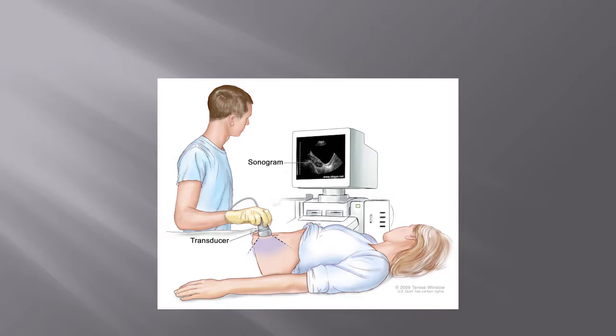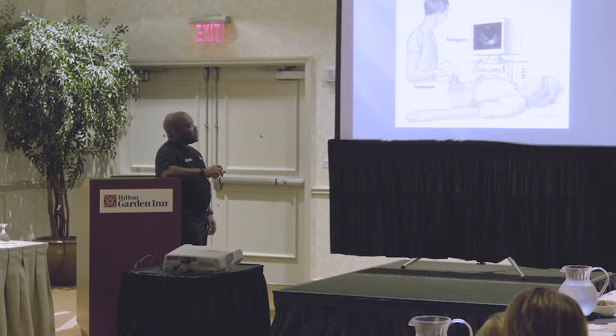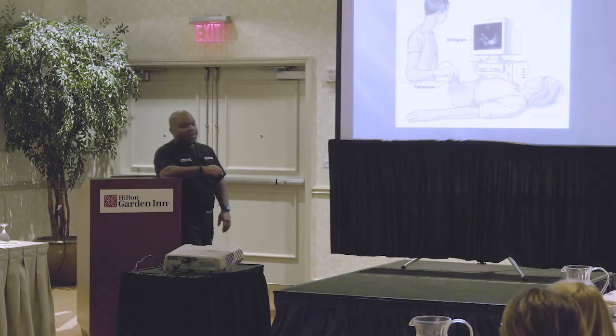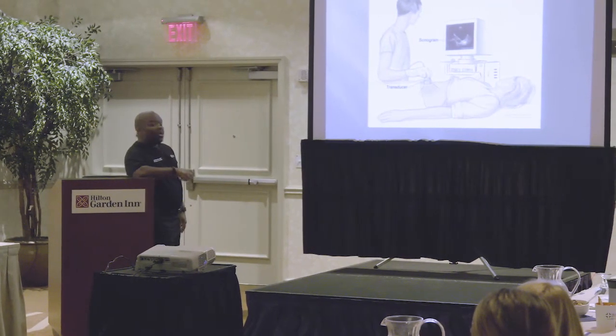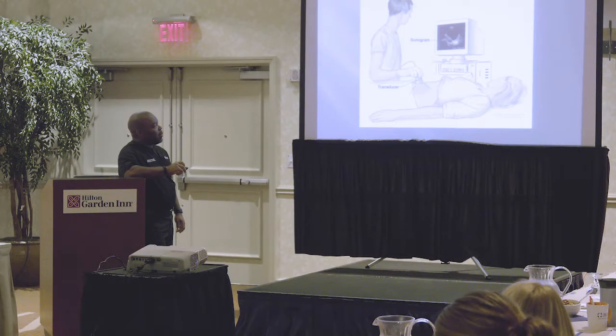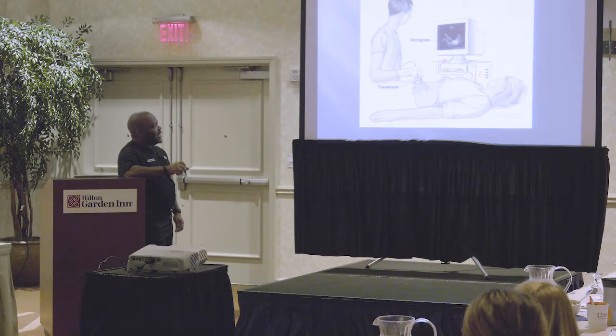And so you say to yourself, why do I need to know that? Well, one of the hardest things that you have to do when you start ultrasounding is not looking at the patient, and it's very contrary to what we're used to, all right? When I teach the nurses to do ultrasound-guided IVs, that is the hardest thing for them, because you're used to looking at the patient. Well, when you're scanning a patient, you're not looking at them at all. Sometimes they don't even know what they look like until you're done, because you're looking at the screen. And as you move the transducer up and down or right and left, you have to be able to track on the screen what you're looking at, okay? So if your transducer is not in the proper location, you're going to miss exactly what you're looking for here.